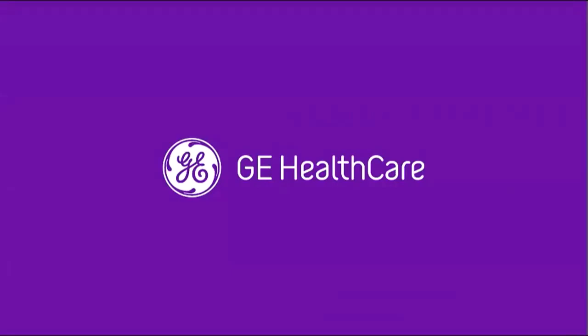Then, can you please throw more light on the difference between fat and fat classic? It's mainly, as I mentioned in the presentation, just the fat saturation strength. So there's not much difference in scanning parameters. There's not going to be much difference in terms of scanning time, for example. It's just the strength of that SAT pulse we're sending. So for fat classic, we're saturating less than for fat. So it's just going to be a way of how your image is displayed afterwards. So I hope that answers the question.